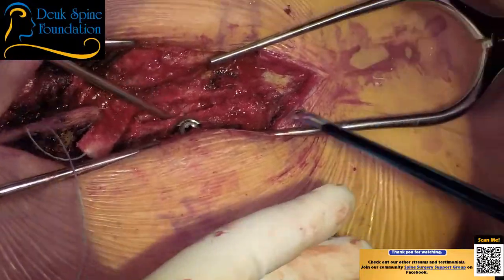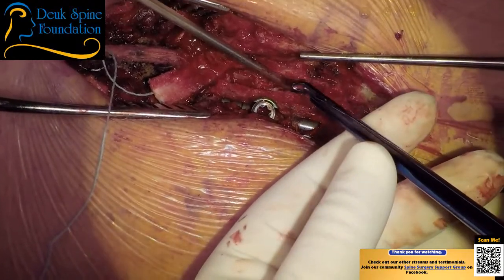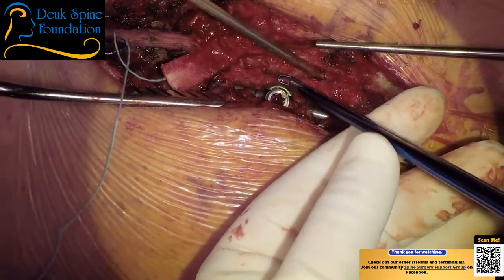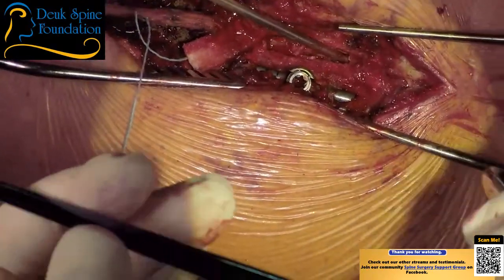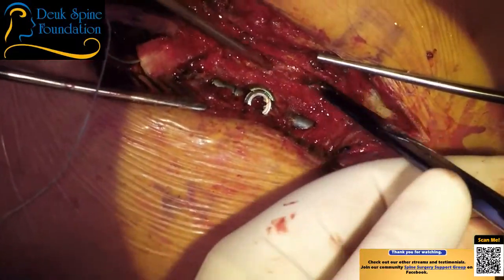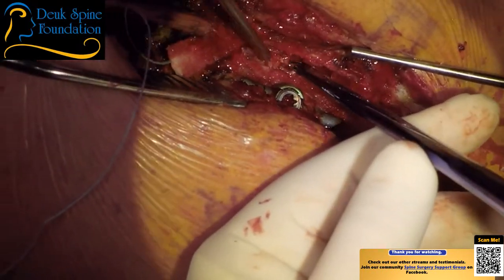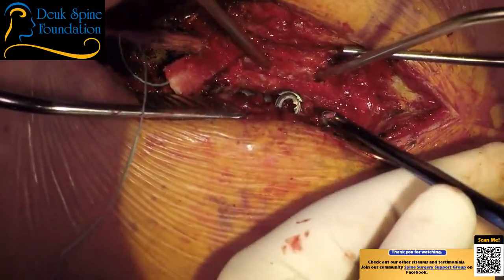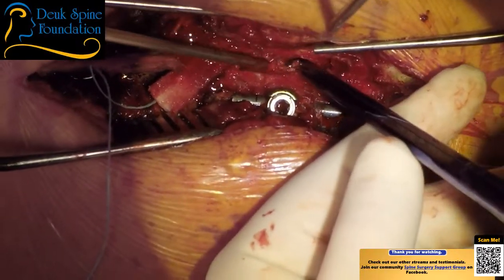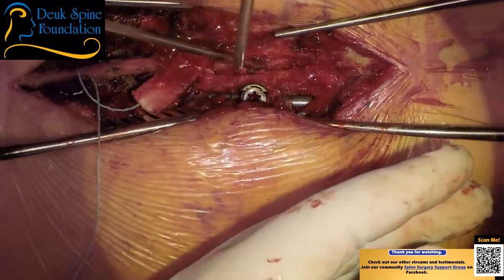Now notice, I don't expect that to happen, but notice the training and the technique. When I lose control, so to speak, I'm not losing control of the instrument, but when it moves in a way that I don't want it to, it moves up and out. It doesn't move down towards the spinal cord. That's something you have to train yourself as a neurosurgeon. We're trained to, when we have moments like that where you suddenly lose resistance to the instrument, like the resistance you're working against suddenly moves, you go up and out. So it's something you have to literally consciously think about. Look at how the spinal cord was just getting crushed right there. Isn't that cool?